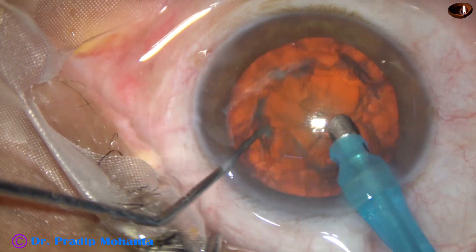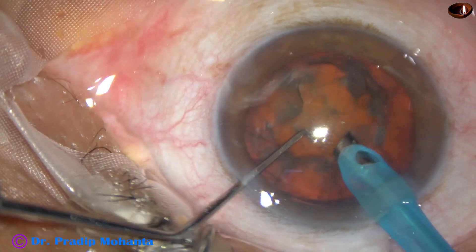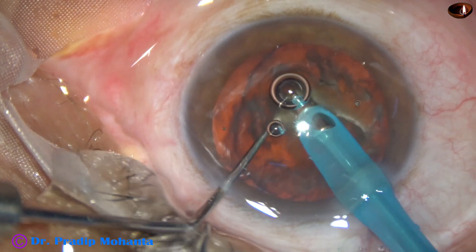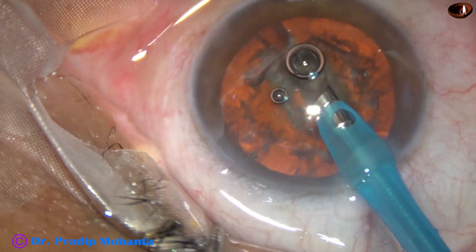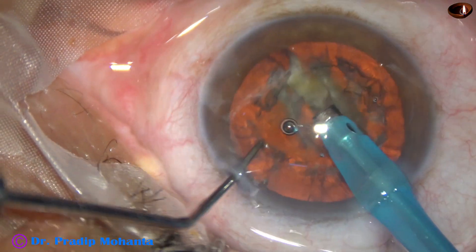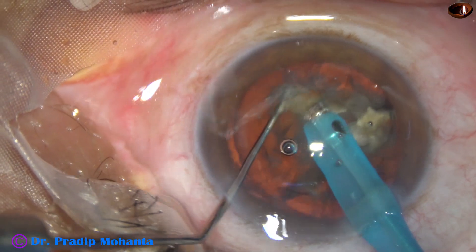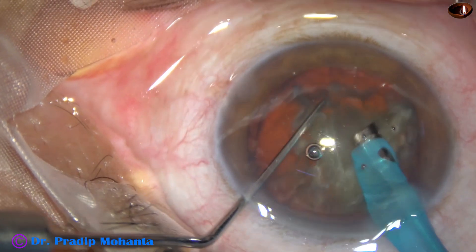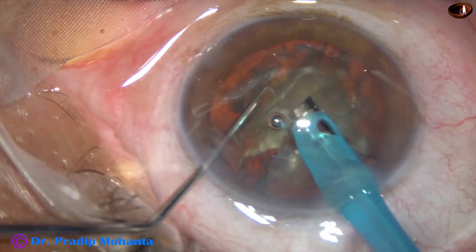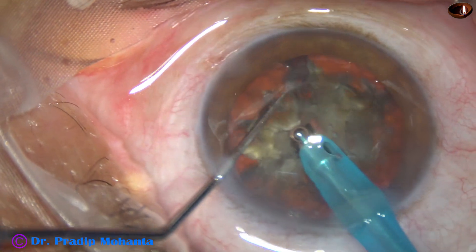Some superficial cortical lens matter is removed. The nucleus is rotated nicely, and now the tip is buried into the substance of the nucleus and the nucleus is chopped. This is the first chop, and now the air bubble is removed. The nucleus is rotated, held at another place, and this is the second chop, and this is another chop on the other hemi-nucleus. So we have got some free nuclear fragments.